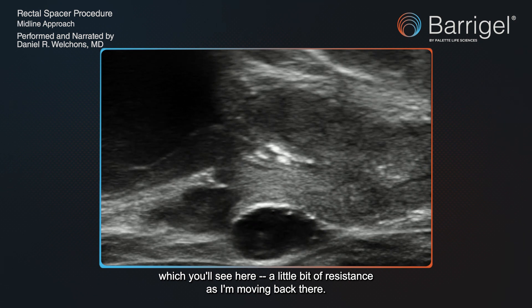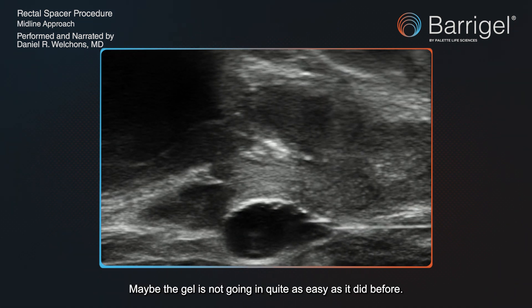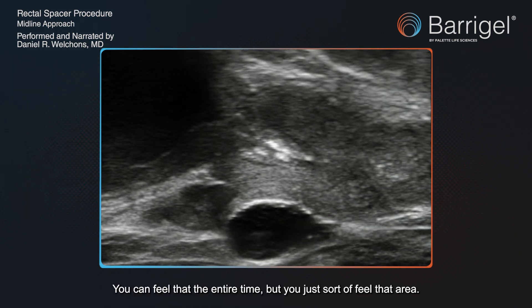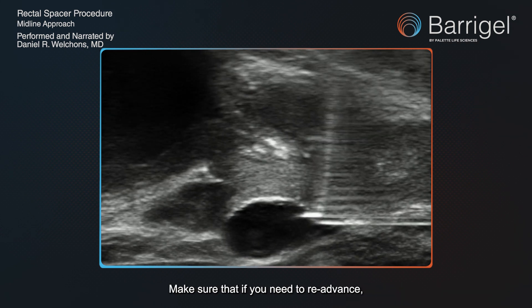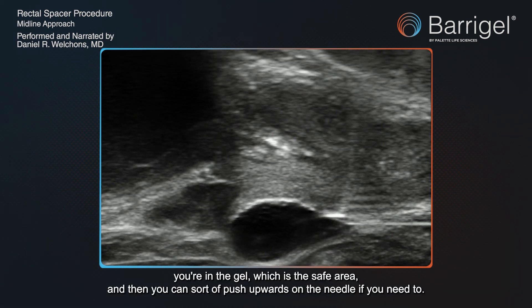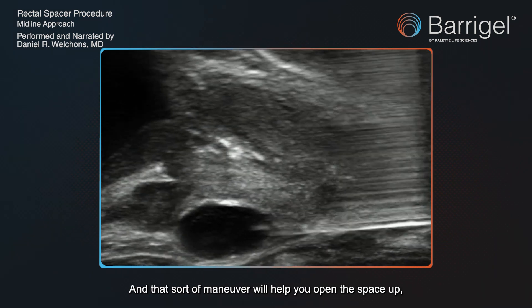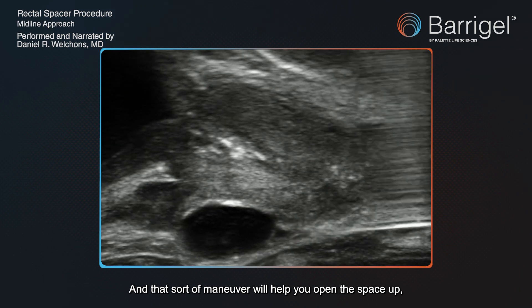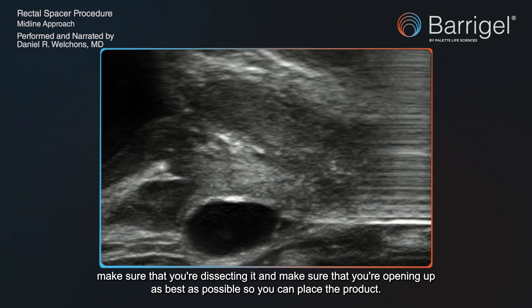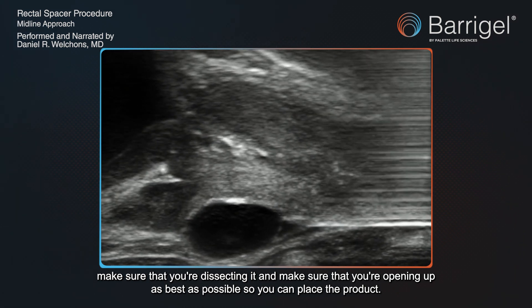A little bit of resistance as I'm moving back there — maybe the gel's not going in quite as easy as it did before. You can feel that the entire time. Make sure that if you need to re-advance, you're in the gel, which is a safe area. You can push upwards on the needle if you need to, and that maneuver will help you open the space up, make sure that you're dissecting it and opening it up as best as possible to place the product.